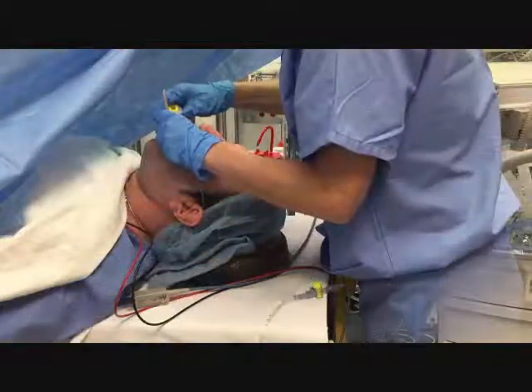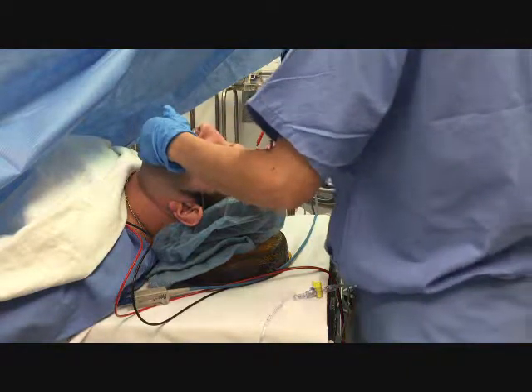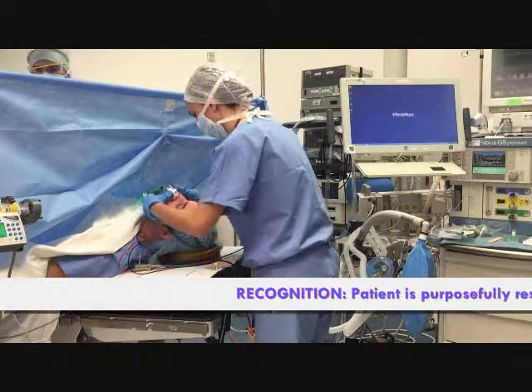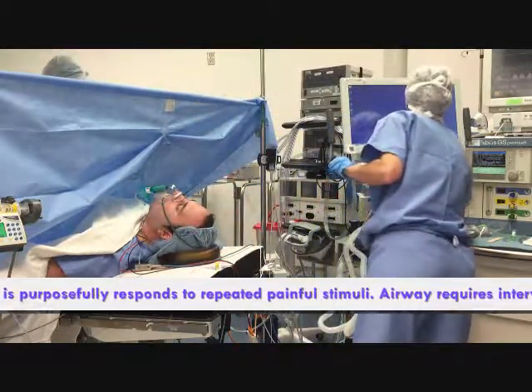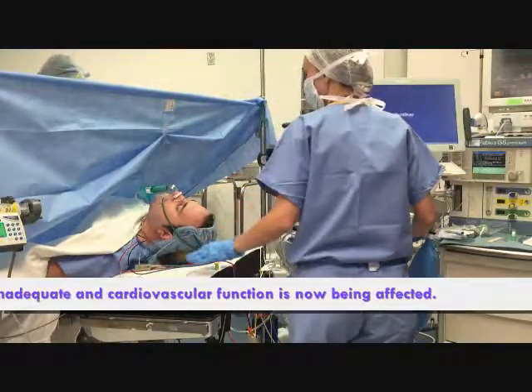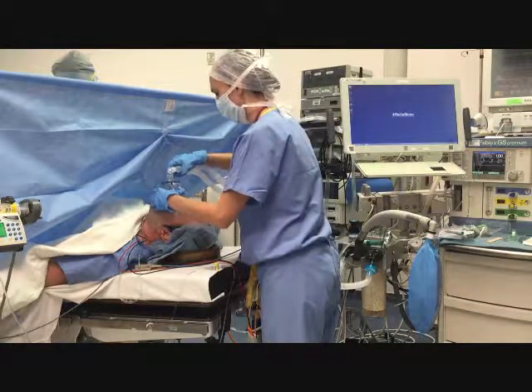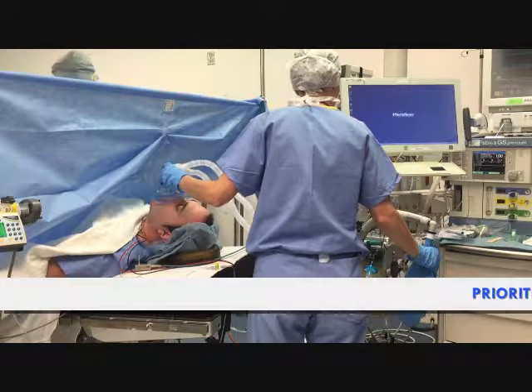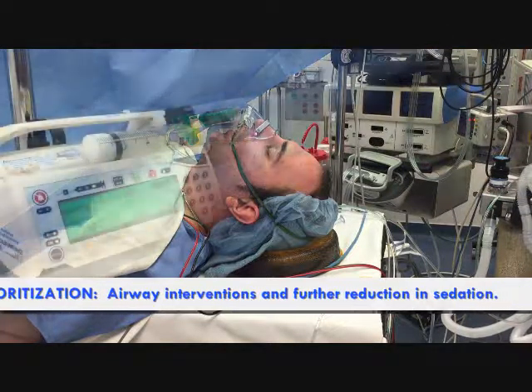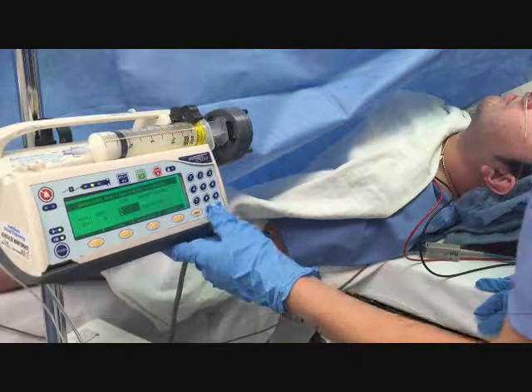You assess that the patient appears to be mouth breathing. An oral airway is carefully placed, and you switch the patient into a venti mask. Due to continued airway compromise, you administer oxygen provided through bag mask ventilation in order to assist Mr. Jones' ventilation. And the propofol infusion is significantly reduced, the dose from 150 mics per kilo per minute to 50 mics per kilo per minute.